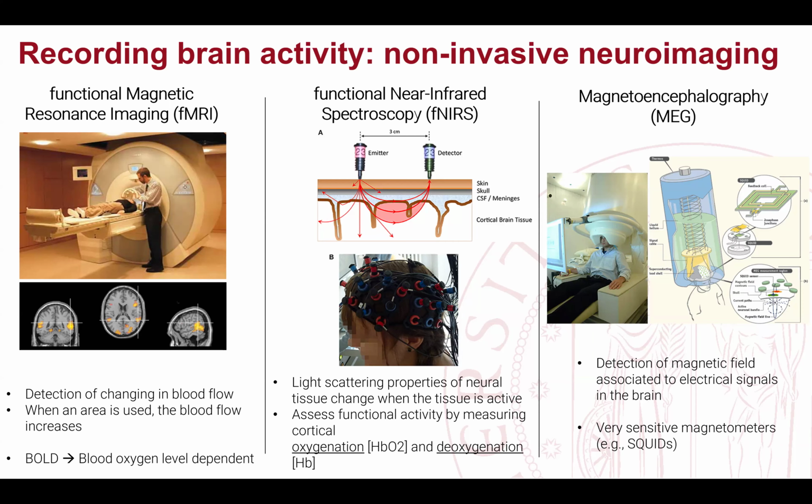But just to let you know, if you end up working with the MEG, almost everything that I will show in this workshop is valid also for this signal. And actually, all the libraries, all the functions, almost everything that I will show for the EEG signal, that is my expertise, can be applied also to MEG signal. So you can easily extend what I will say also to this kind of signal if you end up working with it. But again, given the disadvantages, I won't go into the details.